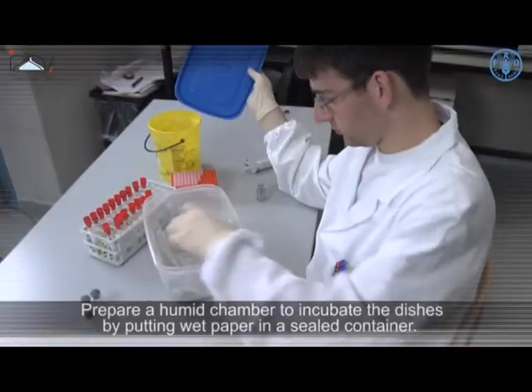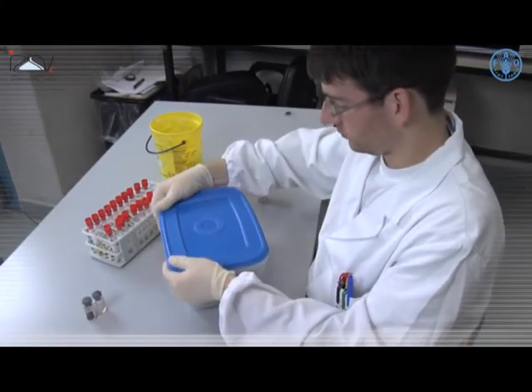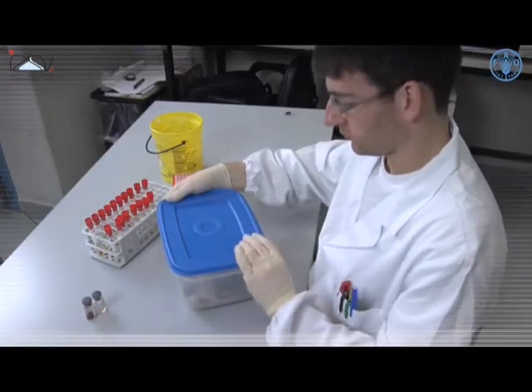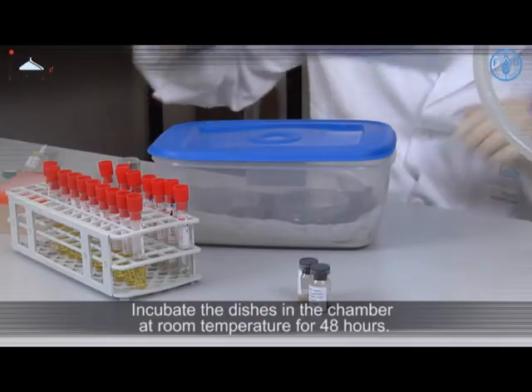Prepare a humid chamber to incubate the dishes by putting wet paper in a sealed container. Incubate the dishes in the chamber at room temperature for 48 hours.